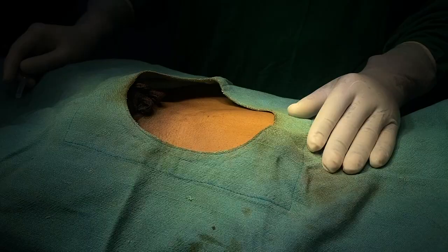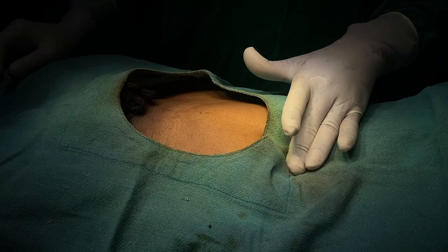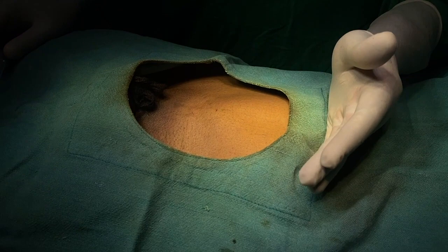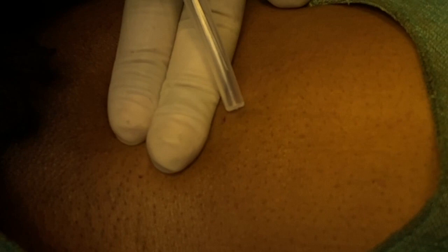On sonography the bladder was containing around 200 ml of urine, which I was not happy with. Since the patient has a stricture urethra, we have hydrated him and given a diuretic. Now the bladder is almost up to the umbilicus. The importance of a full bladder is that the peritoneum gets reflected up. We have also given local anesthesia at two finger-breadths above the pubic symphysis, which is the site of our incision.